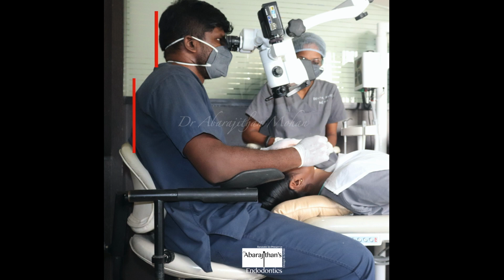Apart from the benefits of the microscope and its efficacy in the treatment outcome, we'll be discussing the ergonomic benefits of using magnification and how to achieve that. There are people who must have been using microscopes for a few years, or people who have bought one recently, or people who have planned to buy one. I would recommend you follow these easy steps to achieve the best out of a dental microscope.